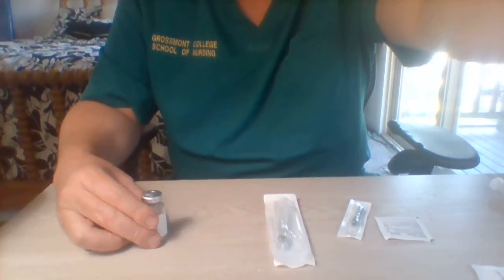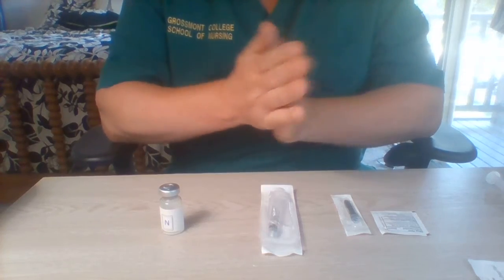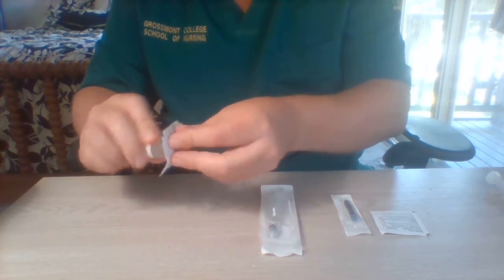So I need a syringe. I've got the vial. I've got a safety cap and an alcohol swab. So perform hand hygiene, release the cap, and vigorously clean with the alcohol swab.